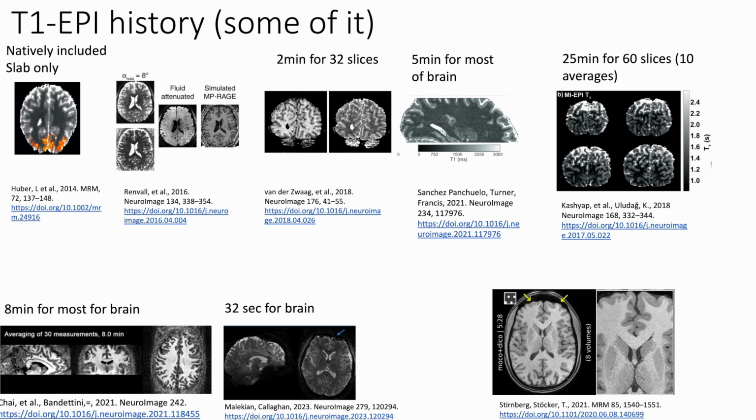Exactly, and that's the motivation for the project, right? We are not the first ones doing T1 weighted EPI. In fact, since the advent of Vaso EPI, we have always done this because Vaso comes along with the T1 weighting. Though not everybody's doing Vaso, and I think Jonathan Polimeni pitched what you pitched just now, to use a T1 weighted with the exact distortion matched EPI. And there are many other groups who did it, but none of them is using it.